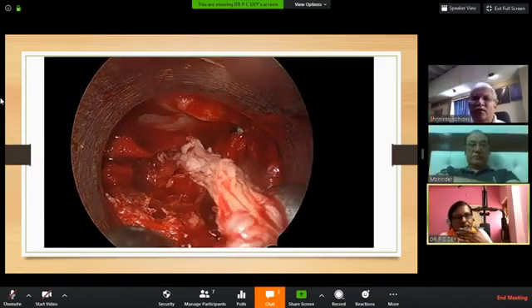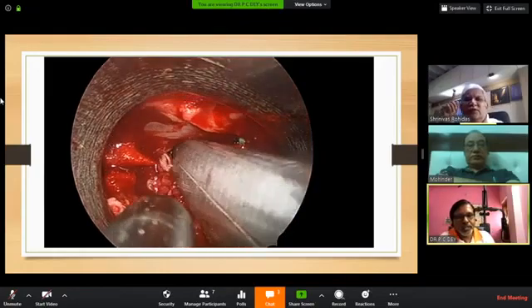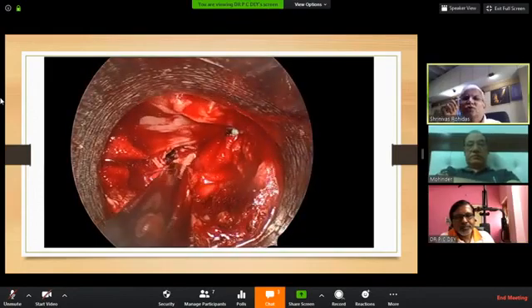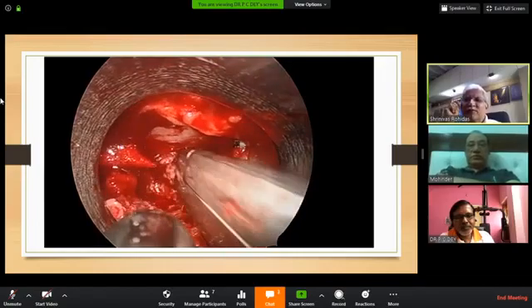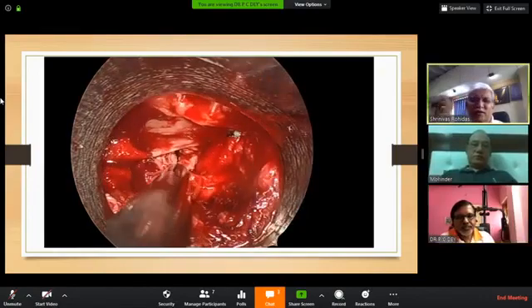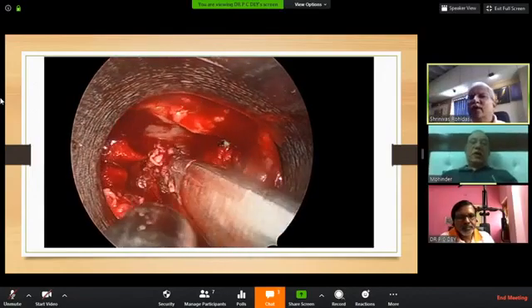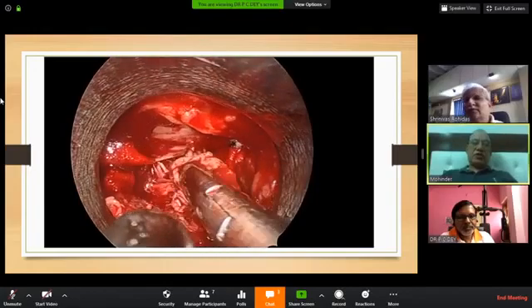One more. Fine, very good. Rohidas, can you tell me what is the wrong I have done here? Sometimes there is excessive bleeding, especially in cervical, where there is no way you can cauterize it. You can use Floseal, wait for a minute and start doing surgery again. That is very good for cervical because we are dealing with cord and the root. Then you have to keep a check on intra-abdominal pressure also, that at times causes venous ooze.